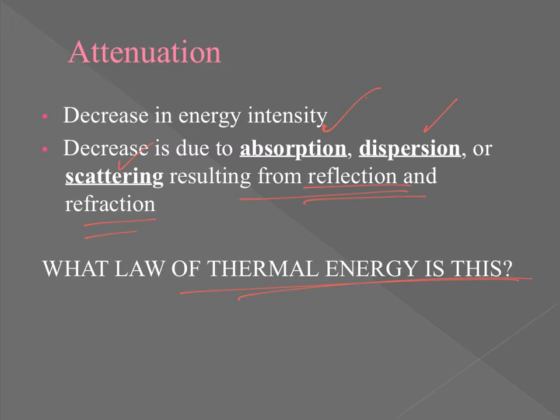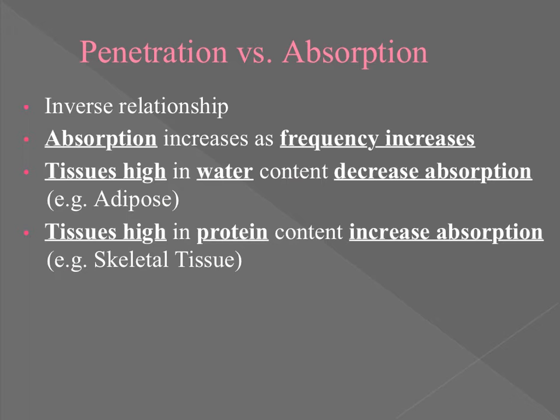So do you see how these laws are carrying forward, right? So we have to do everything we can to minimize the amount of reflection, dispersion, and scattering. Absorption is just going to happen as we progress from layer to layer, but we want enough energy left over for the final layer so that we can actually see these therapeutic responses that we want to occur in the clinical setting.